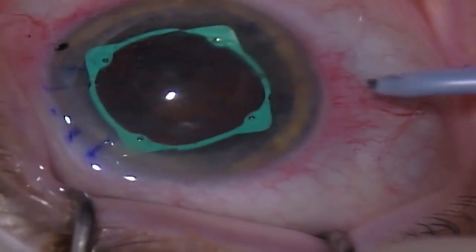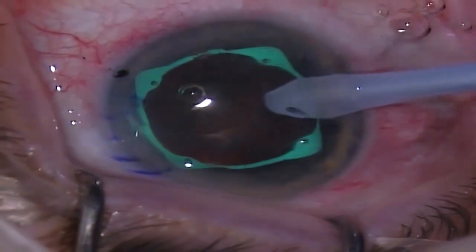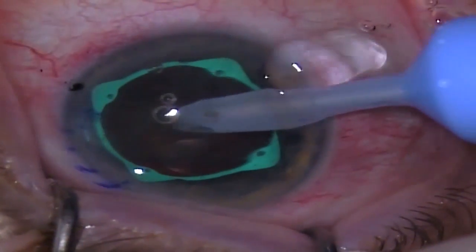Next, I phacoemulsify the nucleus in the capsular bag. Note that the low profile of the beams of the eye ring does not interfere with phacoemulsification.